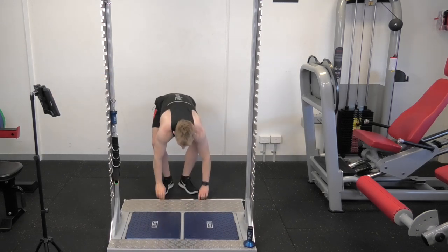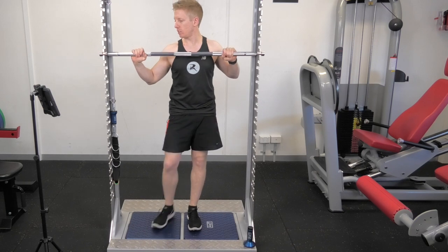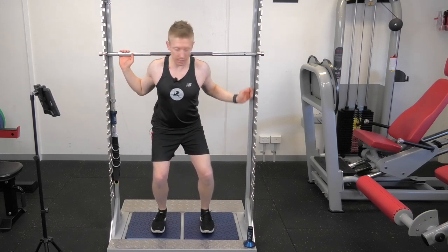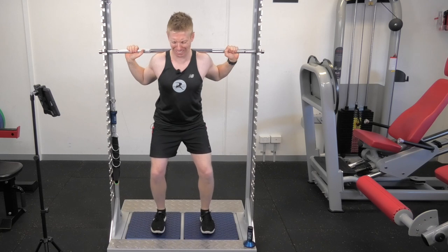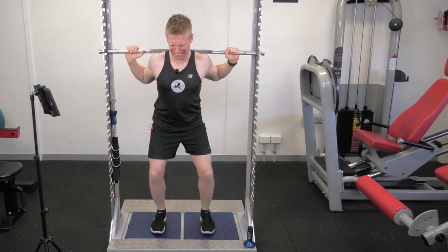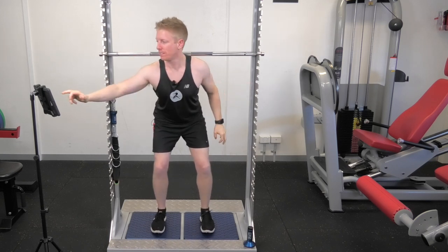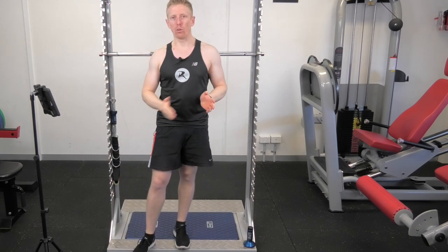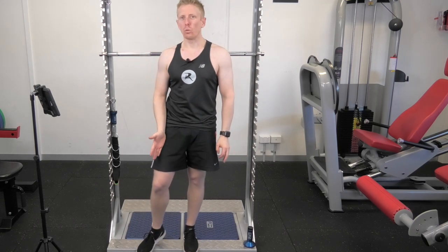Let's get my isometric testing bar and rack it. I'm going to come into a quarter squat position, and we're going to see what my max isometric force is in the squat. I'm going to push as fast and as hard as I can — two attempts. So 24% more force through the right leg than the left leg. And we know from all the testing so far, my right leg is actually the weaker leg compared to the left leg.